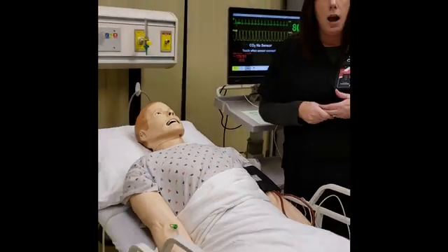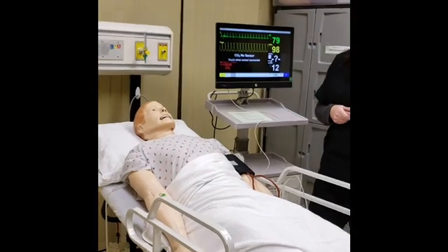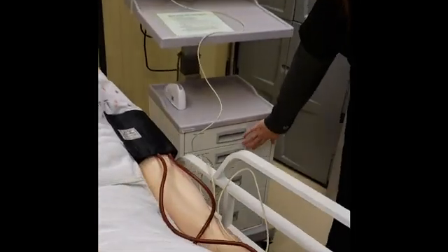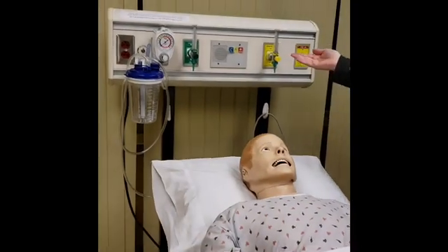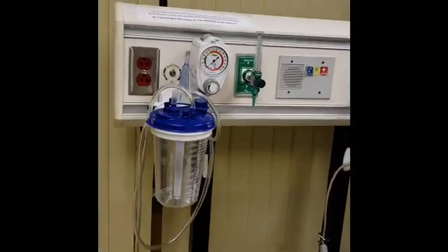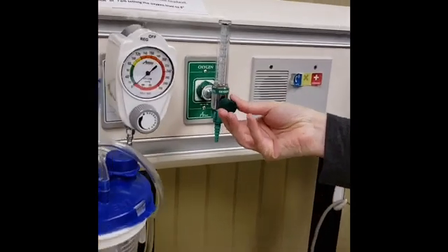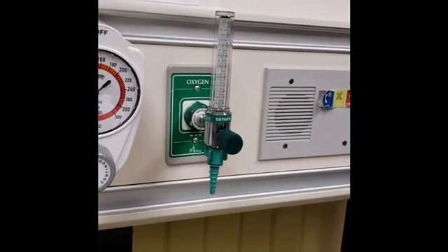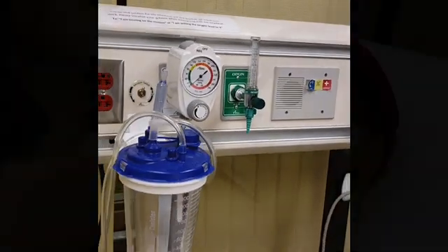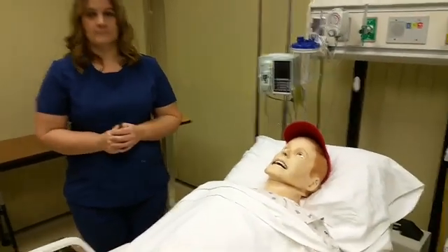As far as adding oxygen to the patient, any of the oxygen supplies you're going to need, cannulas, masks, are all going to be in the bottom of this cart here. Right now, our oxygen and suction is not currently hooked up to a compressor. We do want you to go ahead and simulate turning your oxygen up, and we need you to verbalize the level that you'll be putting it on. And that concludes our orientation to the Simulation Man.